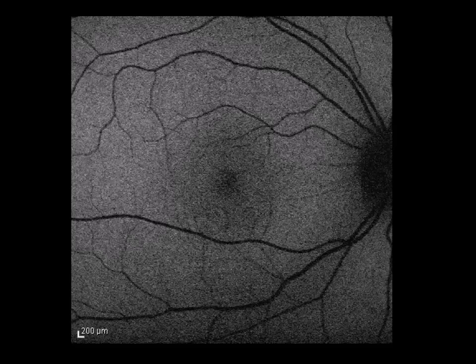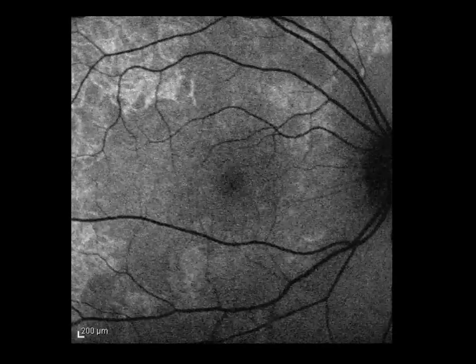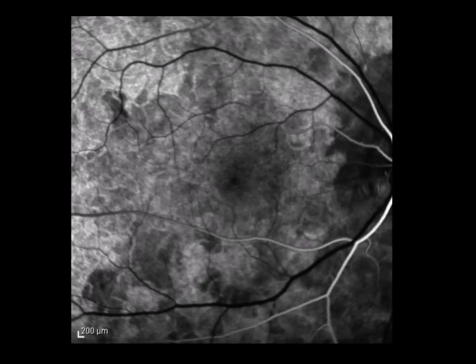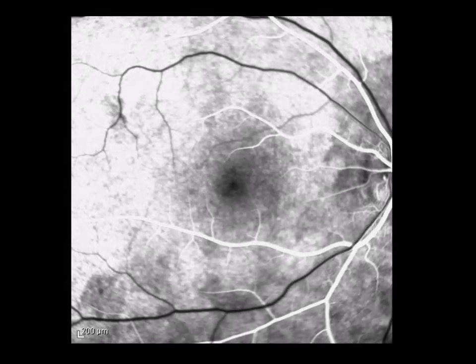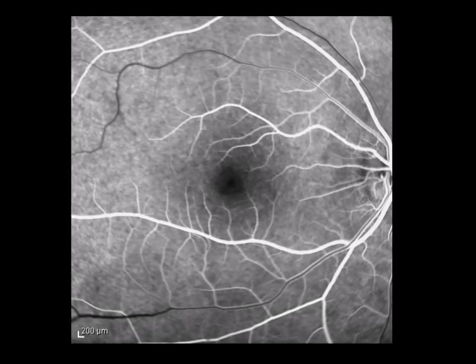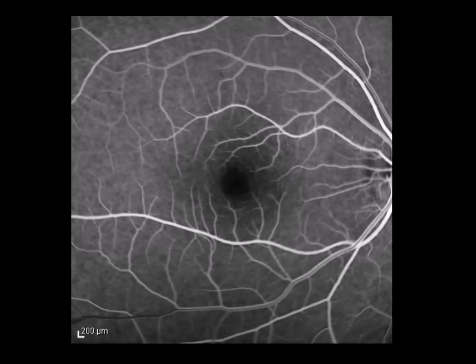This is the patient with CSR. All right. This is a little movie. This is not normal, but I think it illustrates some of the characteristics of a fluorescein angiogram. One of you might have even given this person their fluorescein. This is like a year or 2 ago. This is terrible film quality. But basically what you see happening is a pulsatile nature of the filling. It's all kind of going in slow motion more or less.